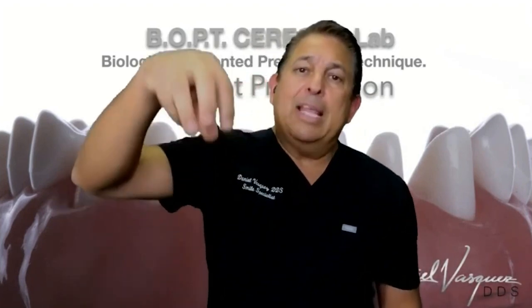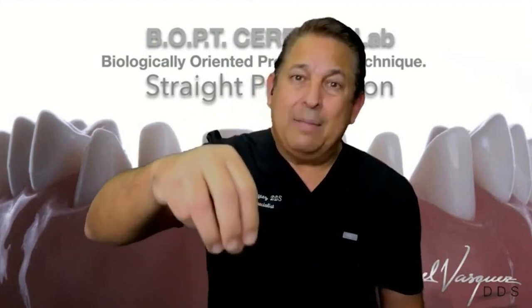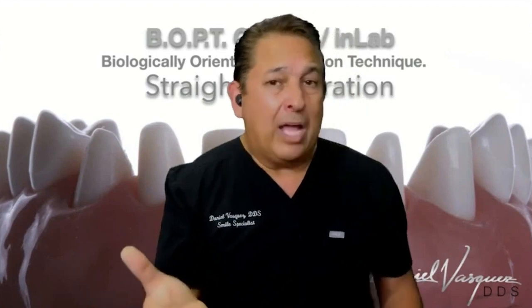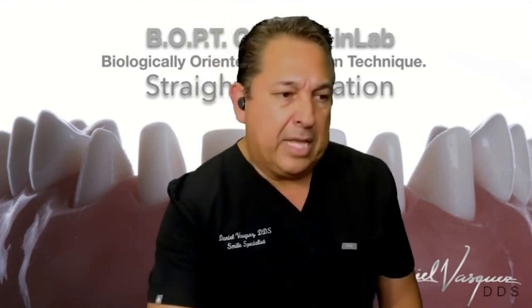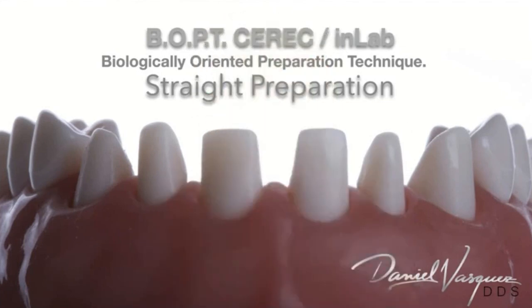If you put, let's say, a temporary crown made of composite that is not well polished, the day you take off the temporary or the healing abutment, you're going to see the tissue is bleeding. Why? Because there was plaque, there was bacteria attached to the crown. That is not going to happen if it's highly polished, whether you call it resin, e.max, or zirconia. But zirconia is one of the materials that tissue really loves. It loves zirconia, it loves gold, and in the old times it used to love amalgam.